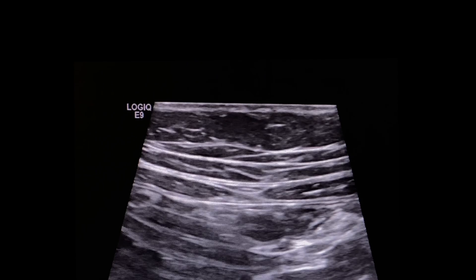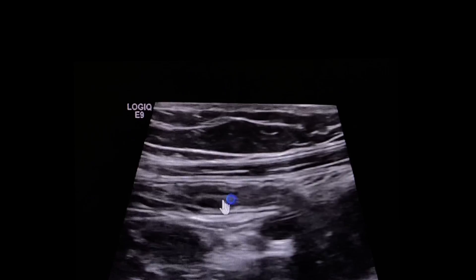Someone wanted to know how to identify the ileum and the cecum or the ileocecal valve. I'm going to go through these clips real quick to see if I can help with that.